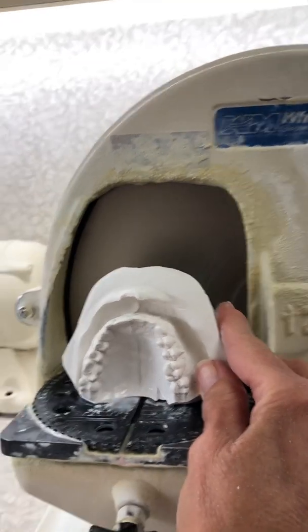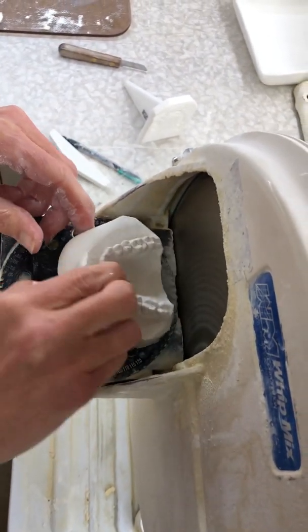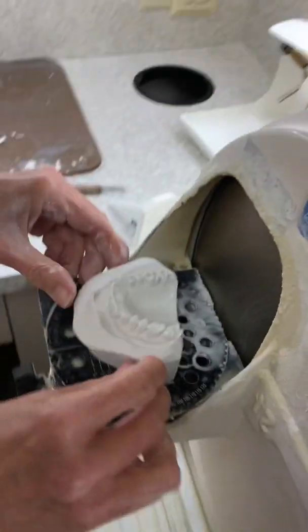All right, so I'm going to go back to the grinder and we're just going to take off a little bit more. And then again, we'll check this. And I'm going to do a little bit more. We still don't have it exactly where it needs to be.